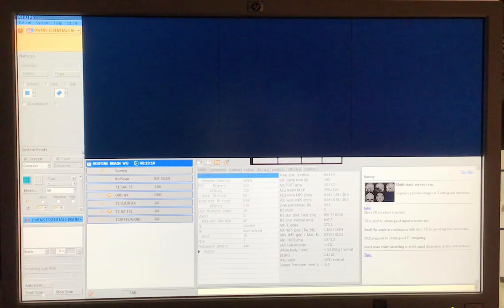Now, what I want to see for you guys and Brenda for your practicals is that you're talking to your patient. And so this is what you're going to be doing to talk to your patient. So you're going to need to turn it on.